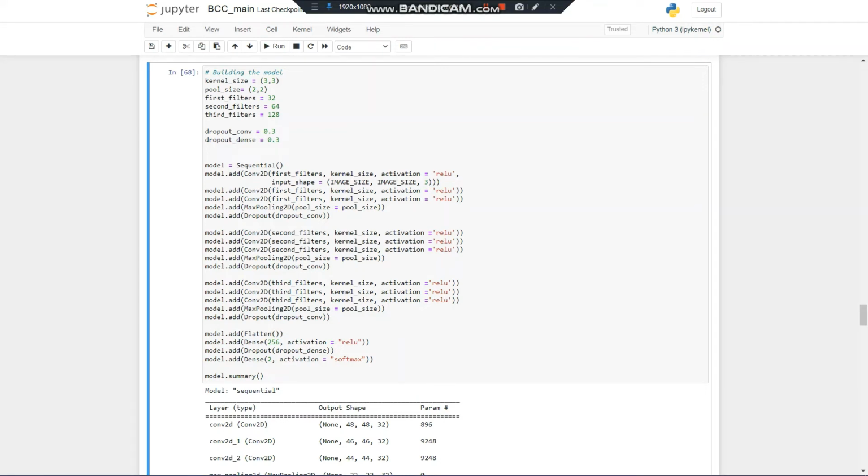Convolutional is the first layer to extract features from the input images or patches. It preserves the relationship between pixels by learning image features using small squares of the input data. The convolutional layer here takes a kernel or filter to extract the features. As we can see, we have a kernel size of 3 by 3 in this model. For the purpose of activation, the activation function that we are using here is the ReLU, rectified linear activation.